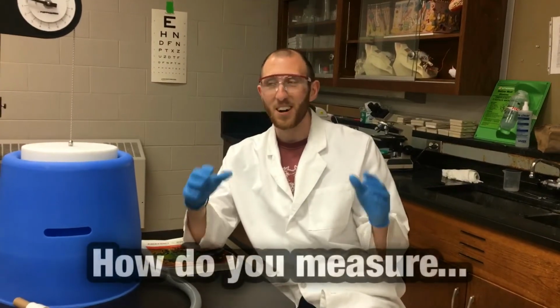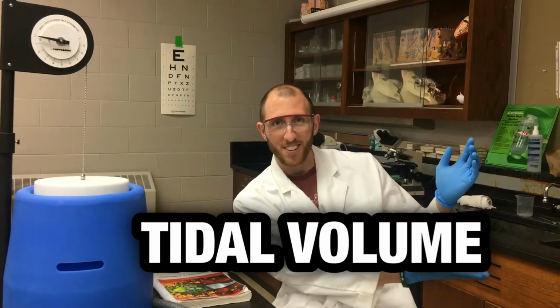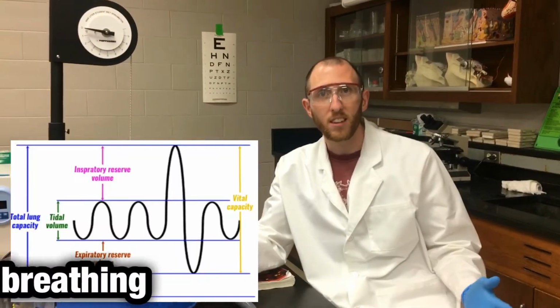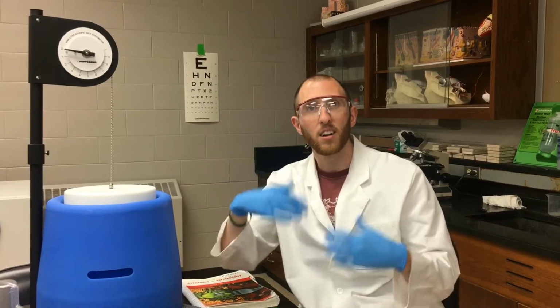So now let's talk about how do you measure something like tidal volume. Now with tidal volume, what that really is normal breathing. Inhalation, exhalation, without exerting more or less air than you normally would.